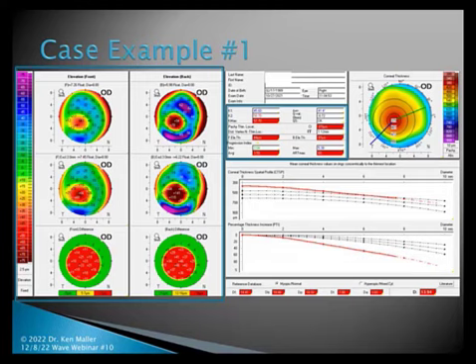Talks about the pachymetry, and you can see there we're at 370, just like we saw on the first screen. Below that is the front elevation thickness, as well as the back elevation, and how that is, the thinnest point, front elevation and back elevation. And you can see how elevated they actually are, both on the front and back, 44 microns and 97 microns on the back, respectively.